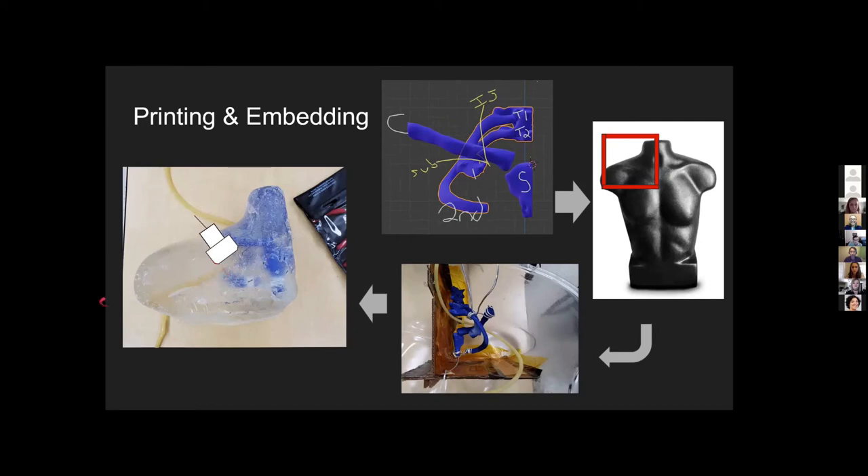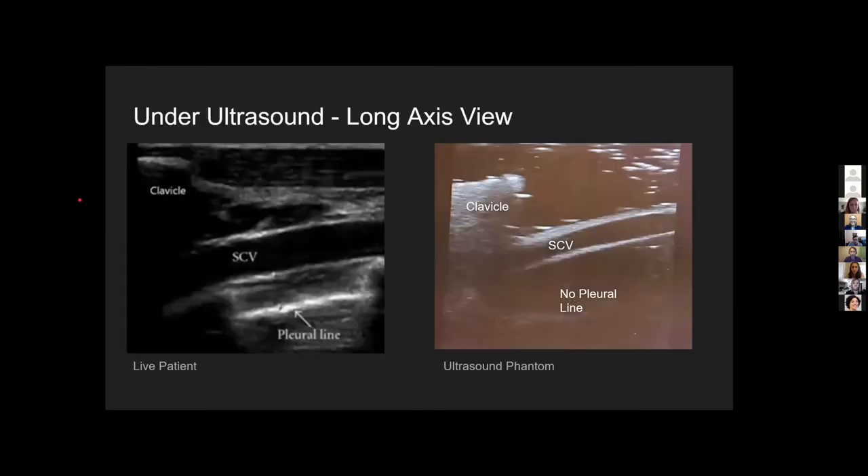A cartoon ultrasound probe shows roughly where an ultrasound probe would go when using this model. On the left is a live patient and on the right is our ultrasound phantom model. You can see the subclavian vein in the long axis coming through both models at approximately the same angle and in the same relationship with the clavicle. One big thing we wanted to include but couldn't fit was the pleural line — a major complication with this procedure is piercing through the subclavian vein and hitting the pleura, but the depth of the model made it so you couldn't see anything roughly below the subclavian vein.